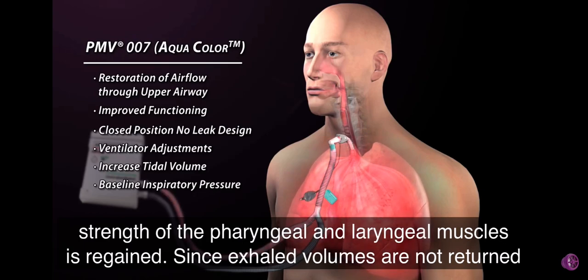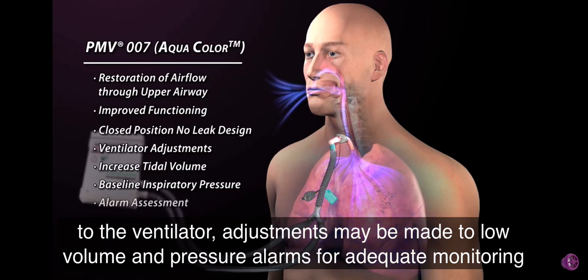Since exhaled volumes are not returned to the ventilator, adjustments may be made to low volume and pressure alarms for adequate monitoring.